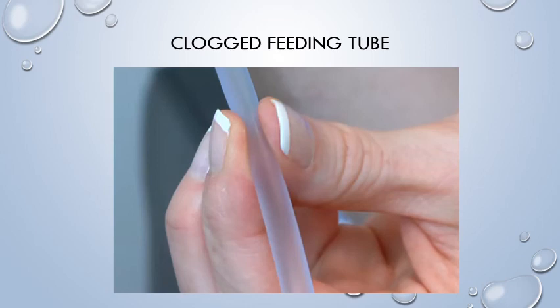A blocked tube may be due to undissolved medications blocking the tube. The best way to prevent clogged tubes is by flushing the tube before and after every feeding and medication administration, or several times a day for continuous feeding with warm water as directed by the delegating nurse.